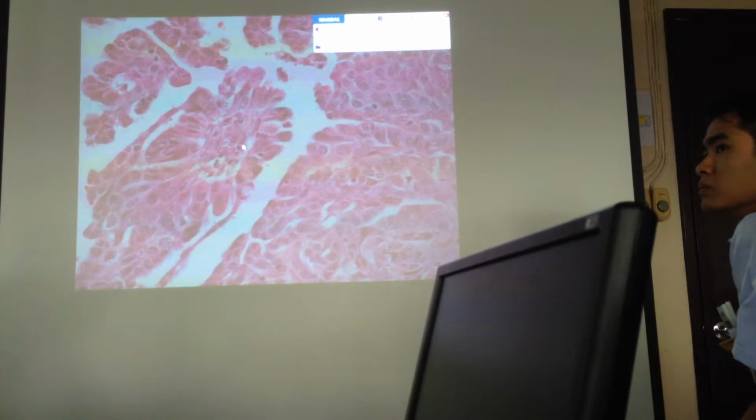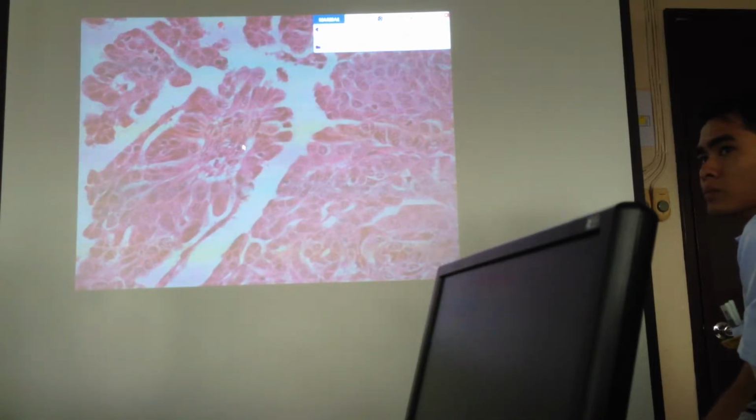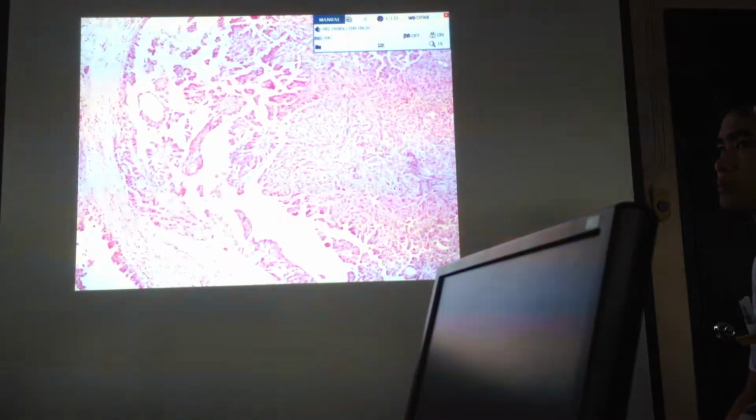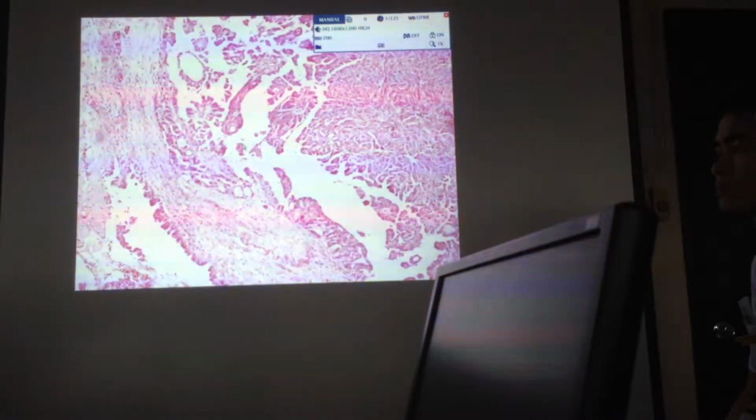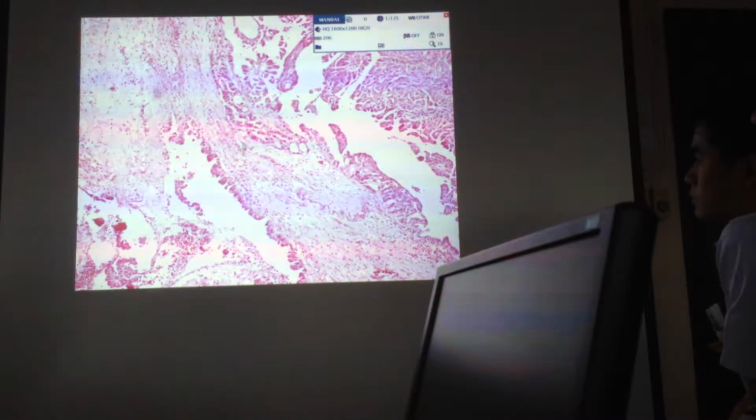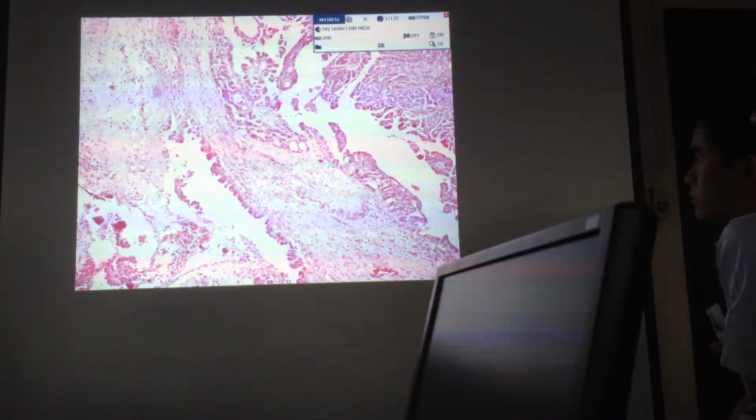Borderline tumors, they label them as intraepithelial neoplasia, but immature. So borderline tumor, that's why some would undergo chemotherapy, others they do not. So that's the difference. Stromal invasion is very important. You have to look for stromal invasion. If you do not see stromal invasion, then it can be borderline. But for this one, we can see that there's already invasion into the stroma. Like this one.